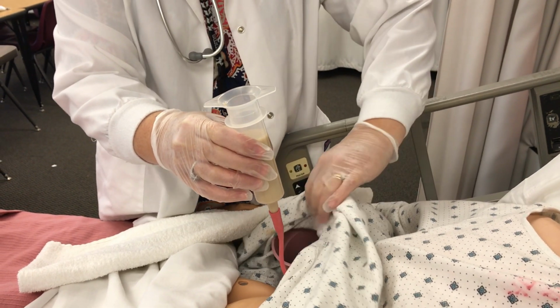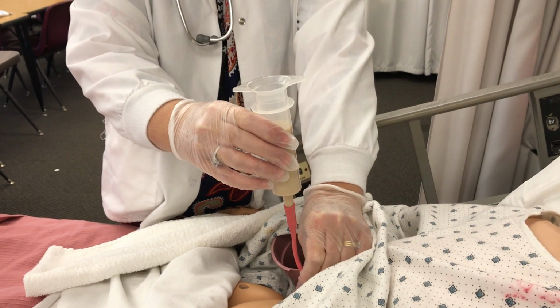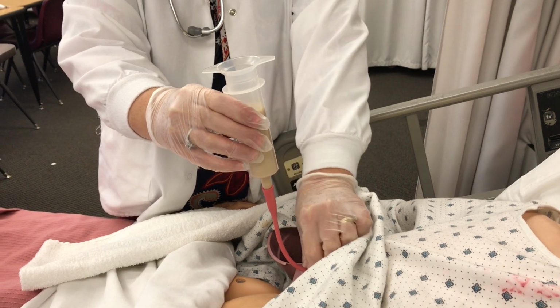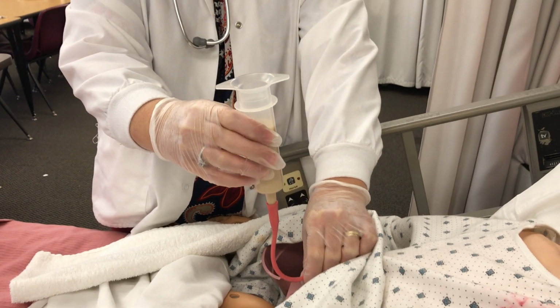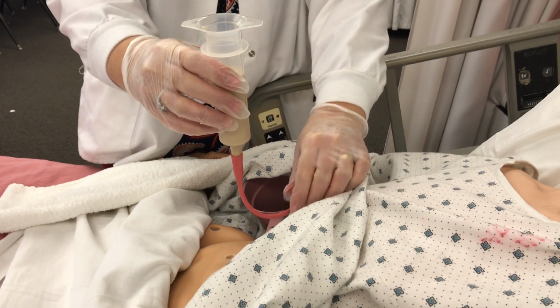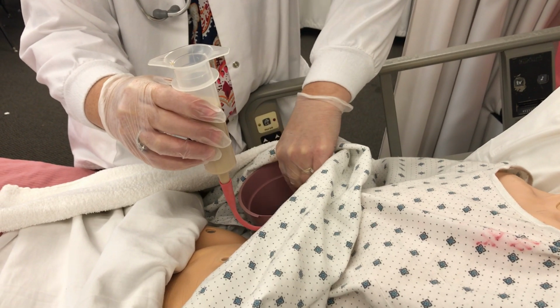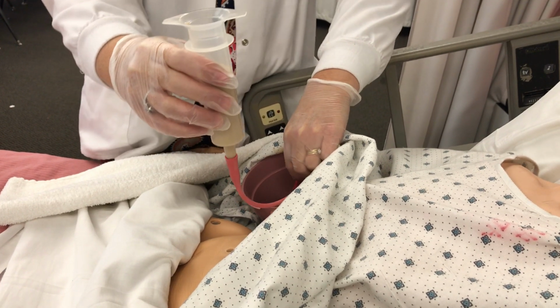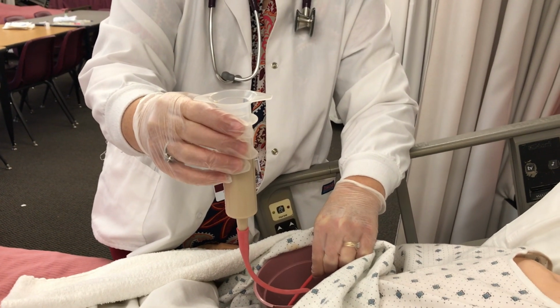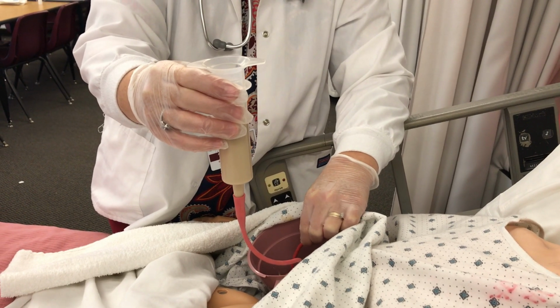Sometimes it is kind of slow. Okay, it's just really slow. This is actually thick, so it's just going to take a minute or two.